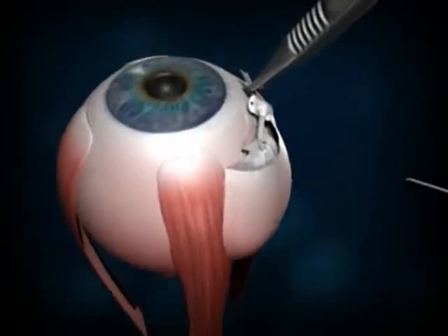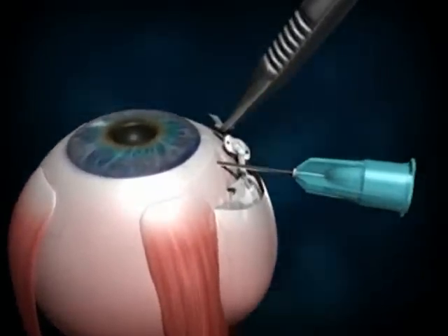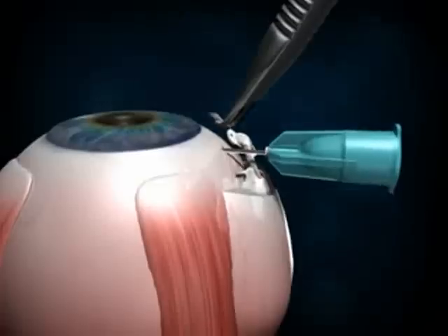Placement of the tube in the pars plana. Using a 23 gauge needle, make a needle track about 3 to 4 millimeters away from the limbus where the partial vitrectomy has been performed.